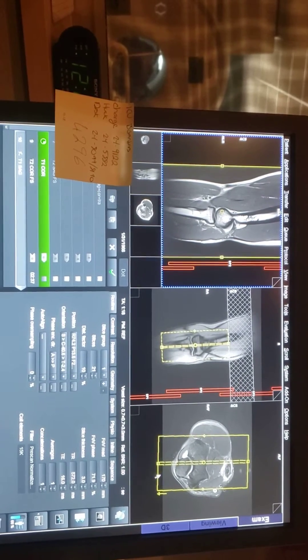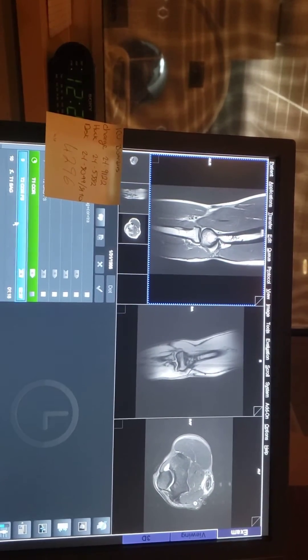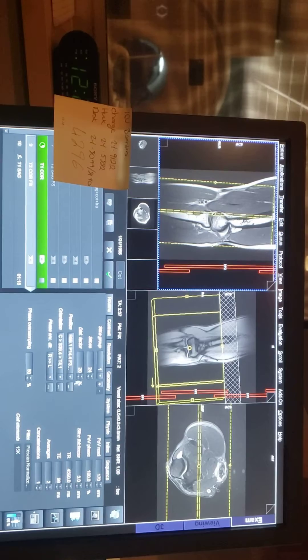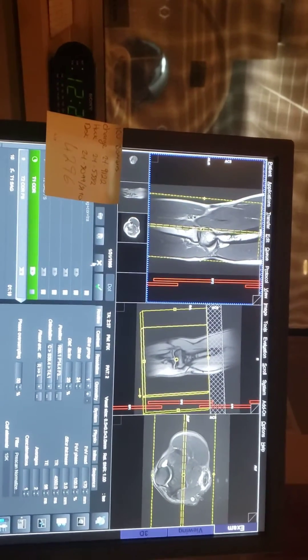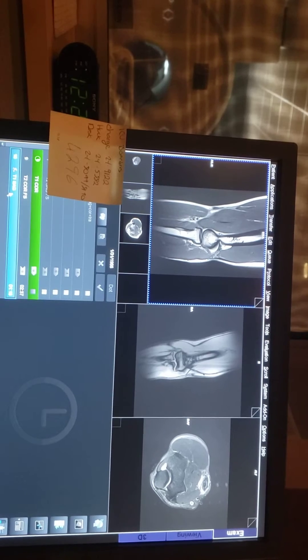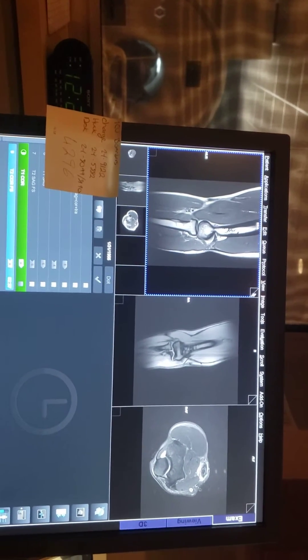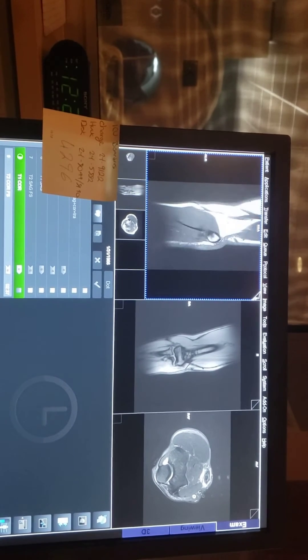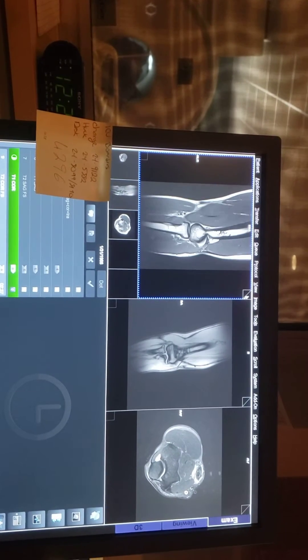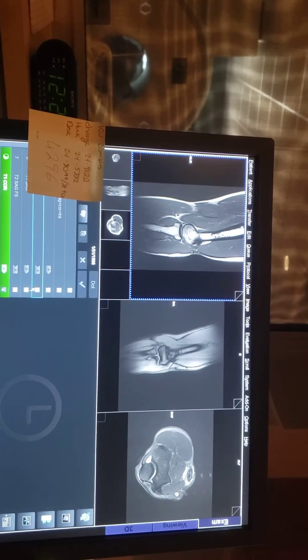Nothing to it, just straight like that. And this was my Coronal setup, so you guys see all three. The Coronal is running now — let's wait to see how it looks. But this is the Sagittal when it finished. Got a good one. And this is the Axial.